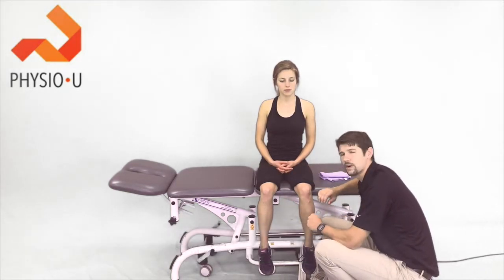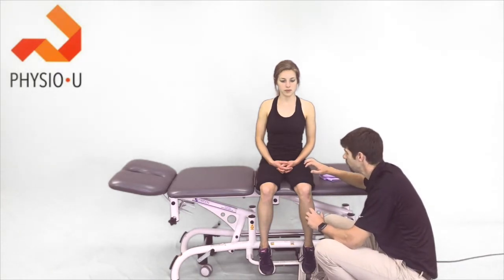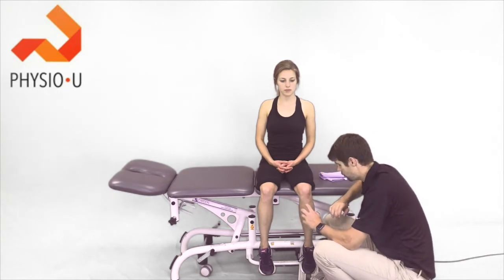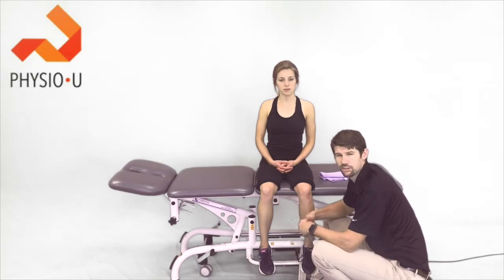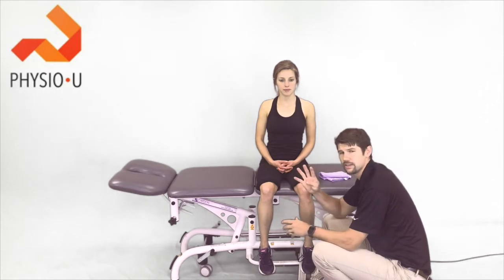An article from 2017 by Jury SPT wanted to investigate four alternative ways to measure max quad strength compared to the gold standard, which is isometric electromechanical dynamometry — isokinetic testing. That's a very big, expensive machine that not many clinics have, so they wanted to find alternatives with similar outcomes. They used four different measurements.